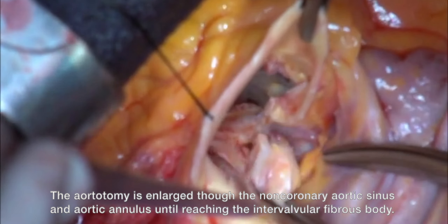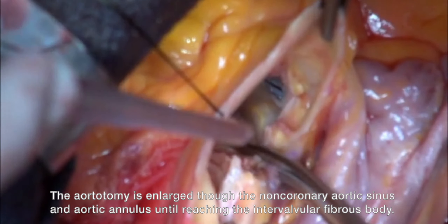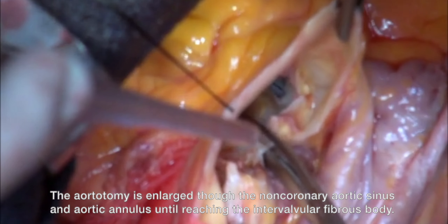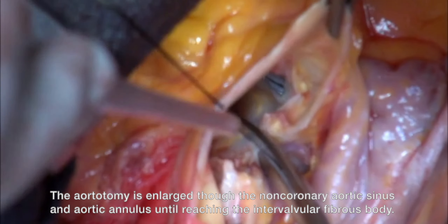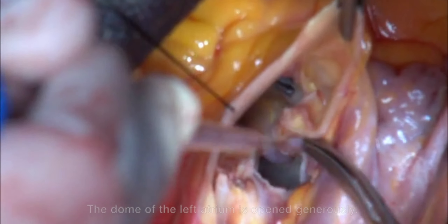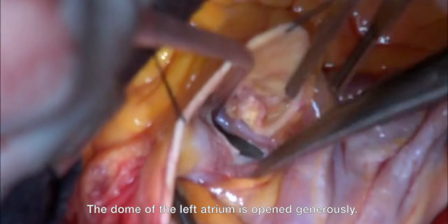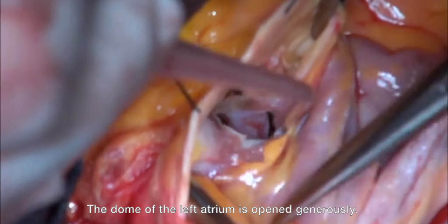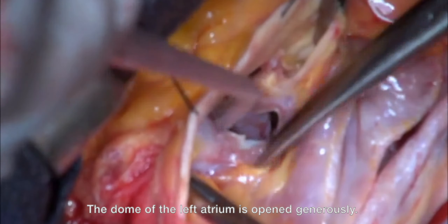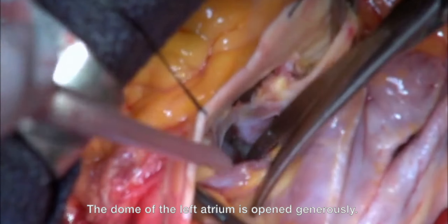The dome of the left atrium is opened generously towards the right pulmonary artery. The mitral valve and the diseased intervalvular fibrous body are radically excised.